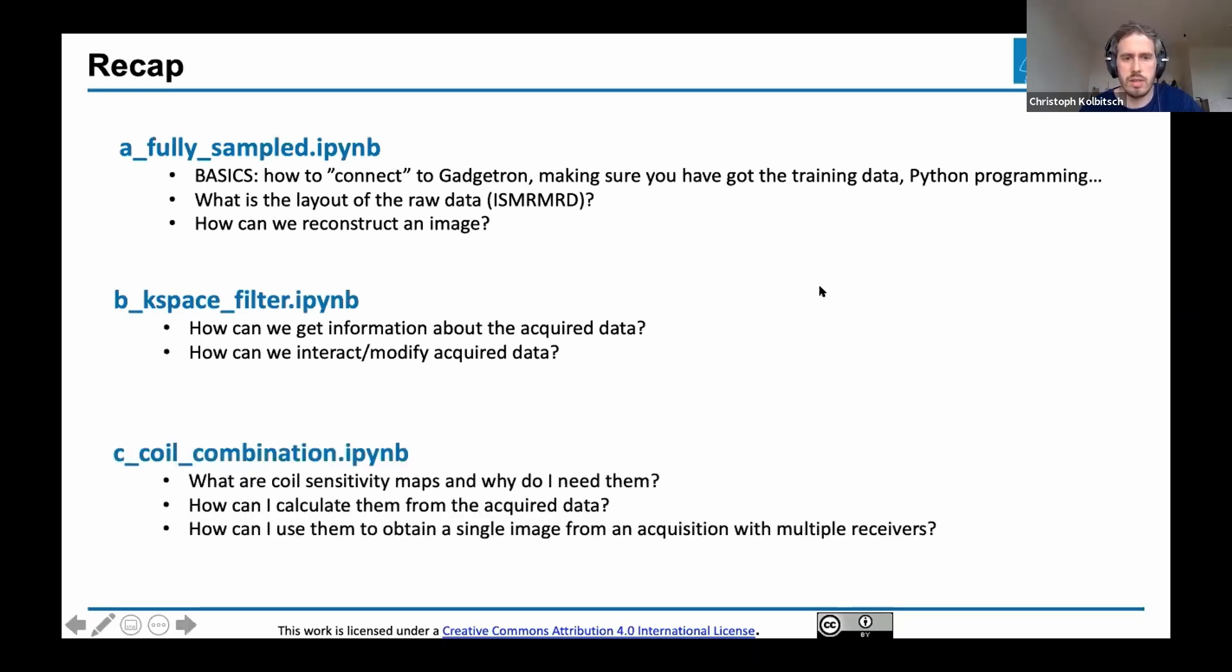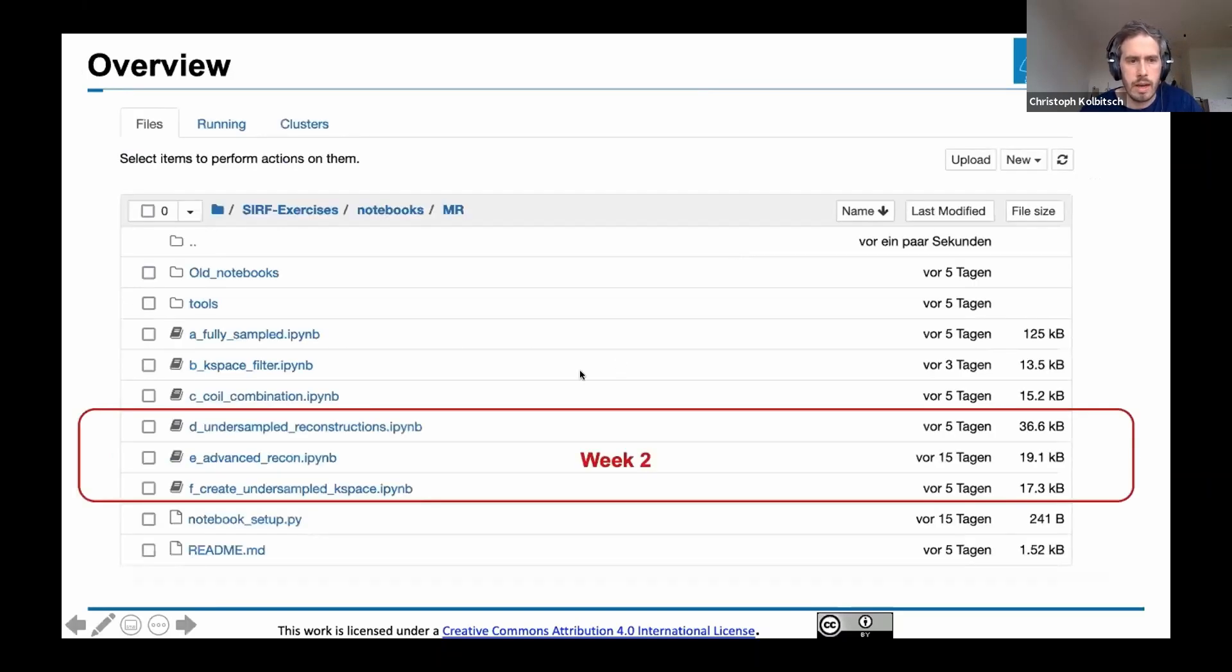The last one, which I'll go into more detail, was the coil combination. This introduced the concept that in MRI we don't just have one raw data set, but multiple raw data sets acquired with different coil elements of a channeled receiver coil. In this notebook, you looked at what the data looks like and how to combine it.